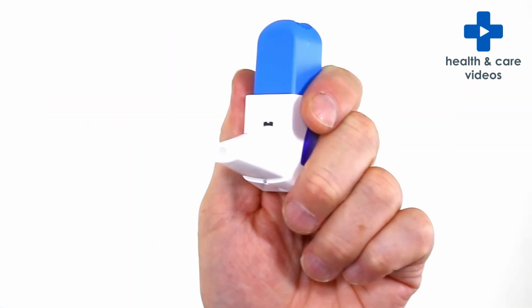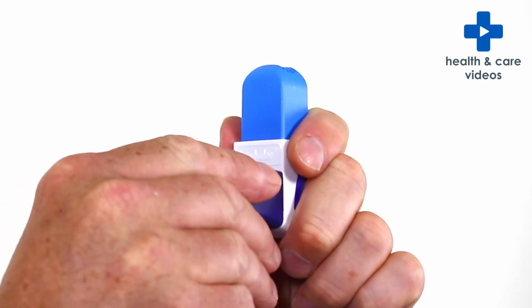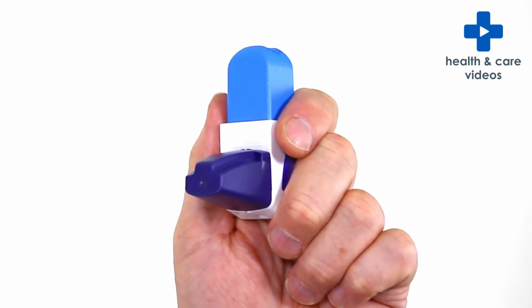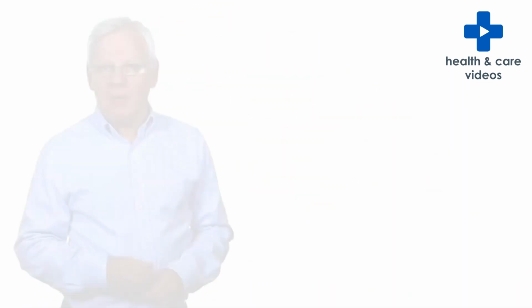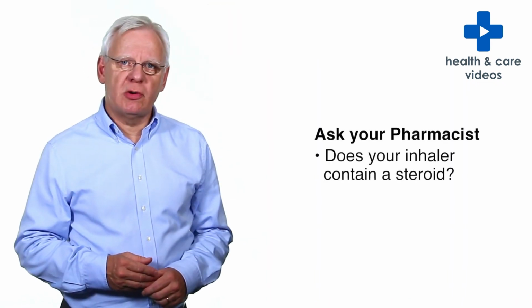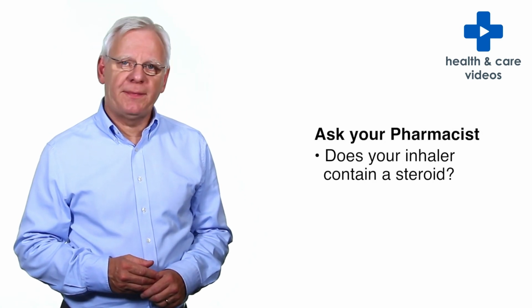As soon as you're finished, replace the dust cap straight away and the protective cap if you're using one. If your inhaler contains a steroid, brush your teeth or rinse your mouth with water and spit it out after every use to prevent mouth infections. Ask your pharmacist if you're unsure whether your inhaler contains a steroid.